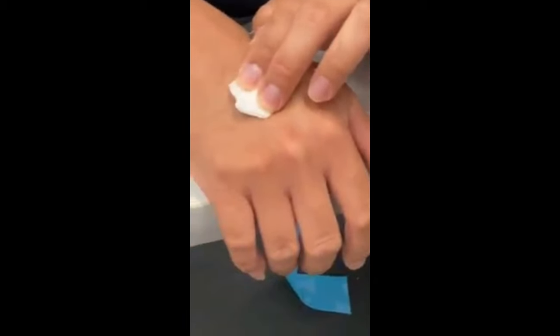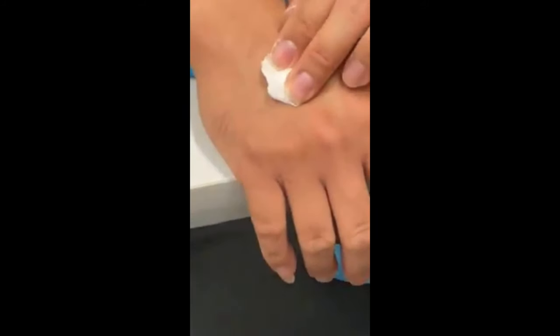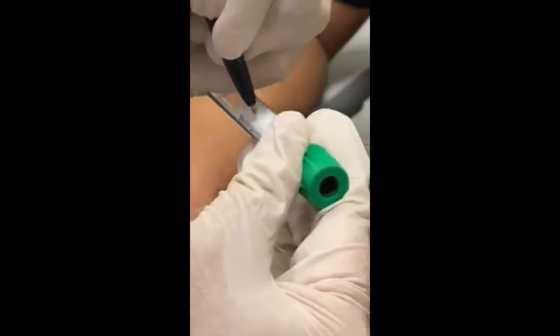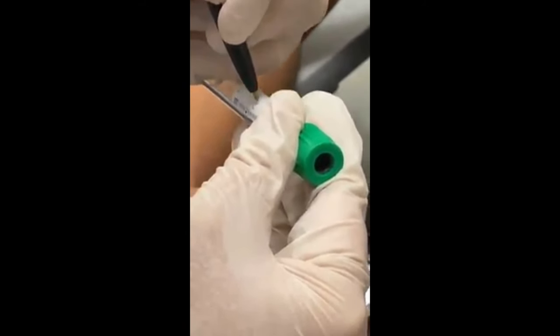And then after you throw away the needle, what do you do with the sample? I will label the sample. Okay, put the sticker on it. And what three things do you put? My initials, and then the date. Today is the 19th. And then also the time. Time, yes.